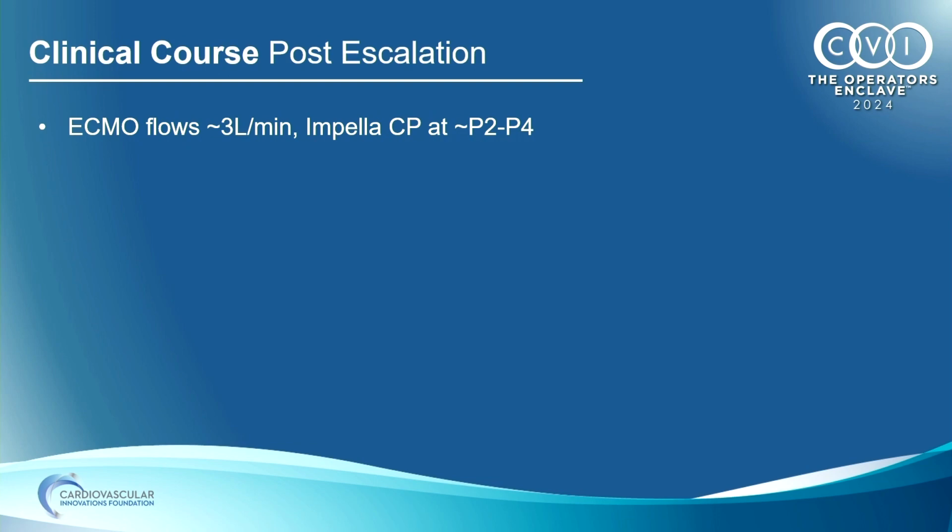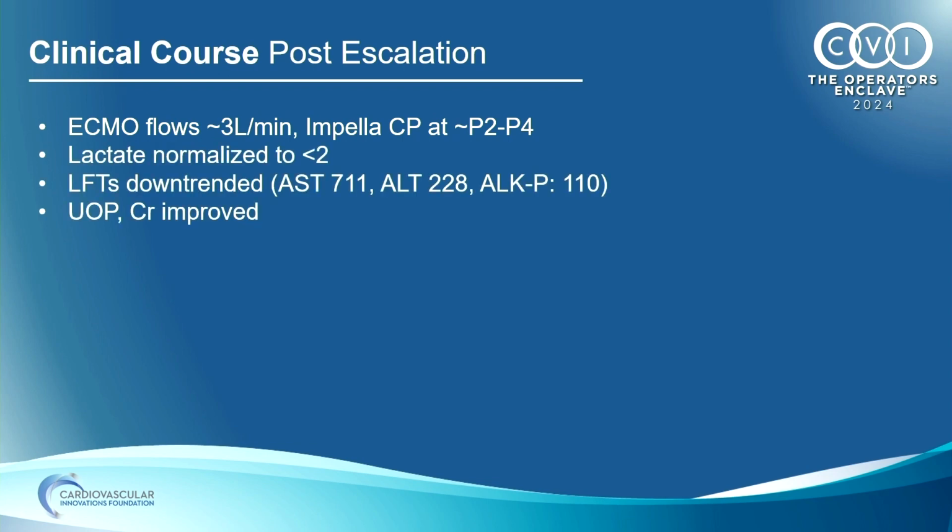So the patient, after that, had ECMO flows around 3 liters per minute. If we tried to go higher, we started getting suction, chattering on the circuit. Our Impella CP was about P2, P4. Lactate started normalizing pretty quickly. LFTs over the next 12 hours started downtrending.